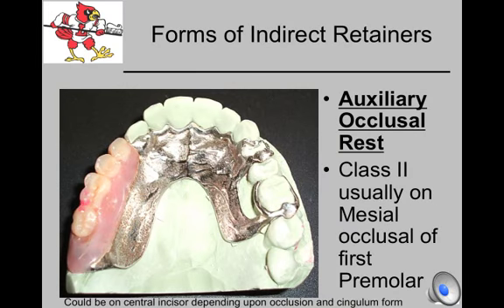The best position for the indirect retainer on this case is probably on the central incisor, if we allow for all the rules of mechanical advantage. But notice the occlusal wear on these teeth. We may have a very deep bite. I hope so, or otherwise the designer of the major connector doesn't know the rules about placement of the major connector's superior borders. We may move over to the canine or the first premolar if the occlusion is a factor.